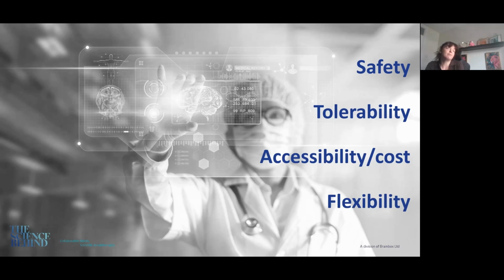And then finally, flexibility is so important in a clinical trial. The day is so busy, you're recording lots of measures, you're on a very strict timeline, especially if you're looking at pharmacokinetics. So ideally, you want something that can be easily integrated into your desired timeline, that's time efficient, and ideally can be implemented in different areas, or potentially can be recorded in multiple people at once if you have multiple participants in on the same day.